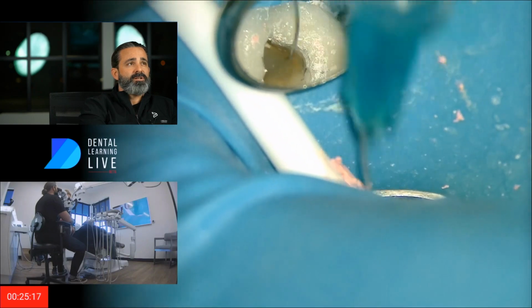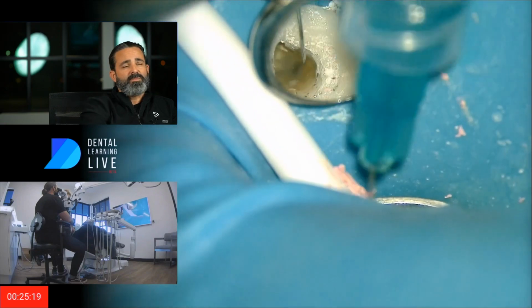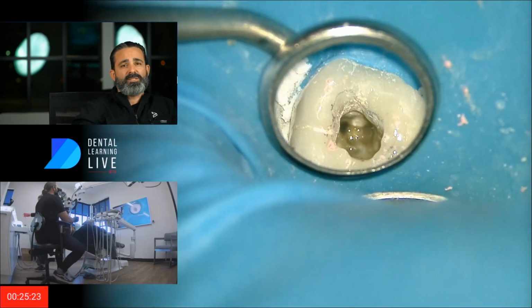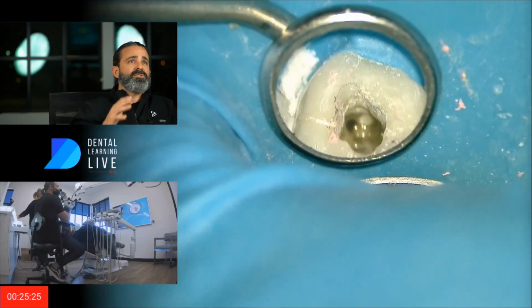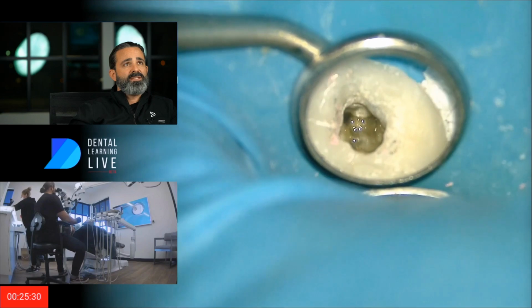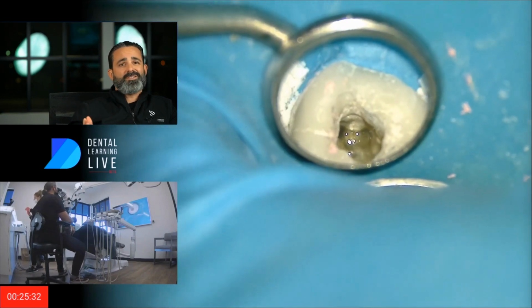You can see I still got the gutta percha flowing on my section there. And then, sometimes I go back to the solvent at the very end just to triple check myself. If I start seeing clouds of pink come up, then I know I still got some gutta percha somewhere hidden inside that anatomy. So those are my techniques.